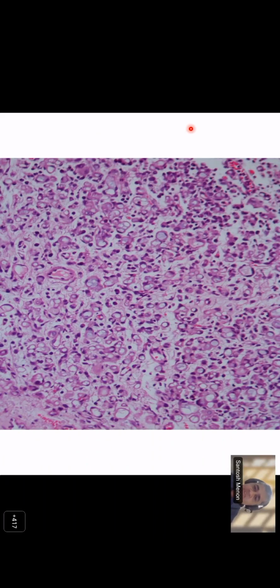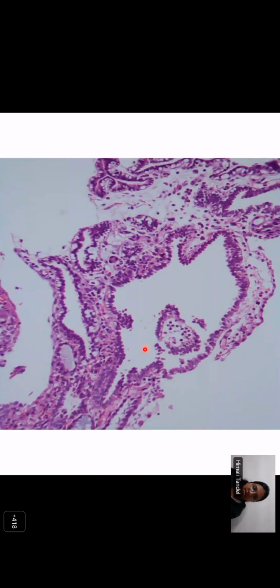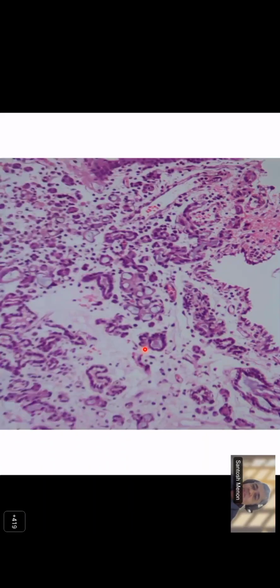Did you think of nephrogenic adenoma? Have you seen a nephrogenic adenoma? I have not seen it, but I read it after the case. You should keep this in mind because this is a differential between benign and malignant. One is a signet ring carcinoma, which is highly malignant, a killer disease, whereas nephrogenic adenoma is a reactive and benign condition. Generally, if you get a history of instrumentation, long-standing cystitis, stones, some kind of inflammation in the bladder, or radiation, you have to think of nephrogenic adenoma.